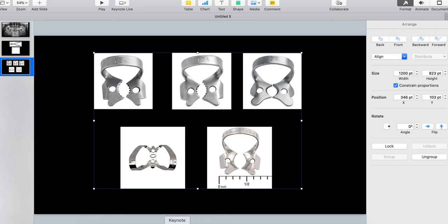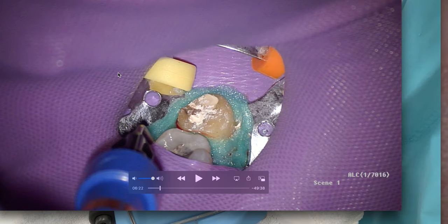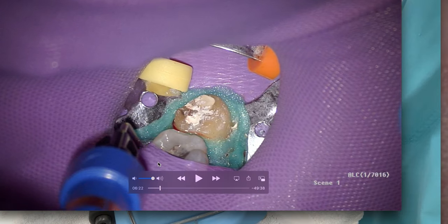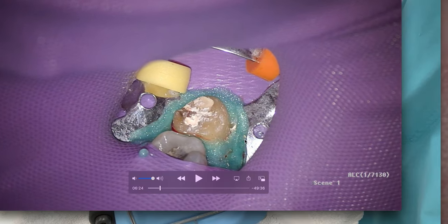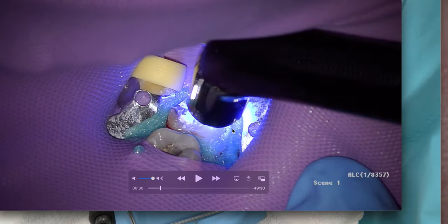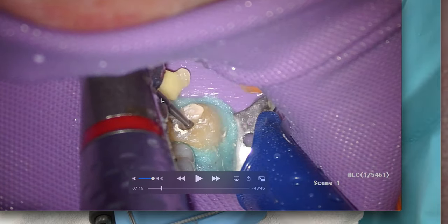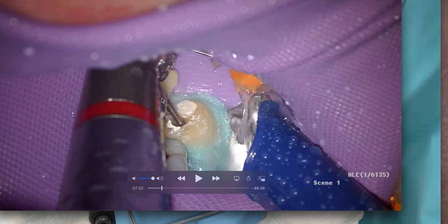Anyway, let's go through the case. Excuse me. Lynn was referred to me by my great friend Dana. This tooth was diagnosed as symptomatic irreversible pulpitis with normal apical tissues — it was cracked. They placed a crown; it didn't relieve the symptoms. So I'm going to take my long-shank number 4 round bur. This bur is seeing the end of its days so we're going to discard that and use a number 2. It's tooth number 37, so we're going right into the center.